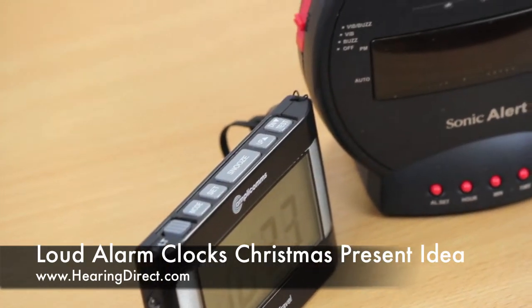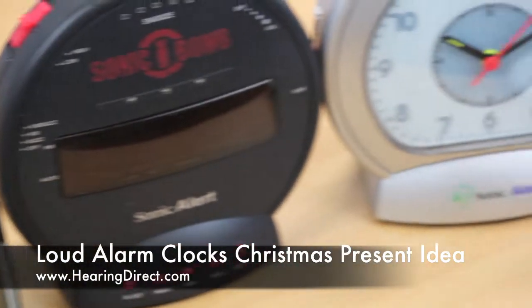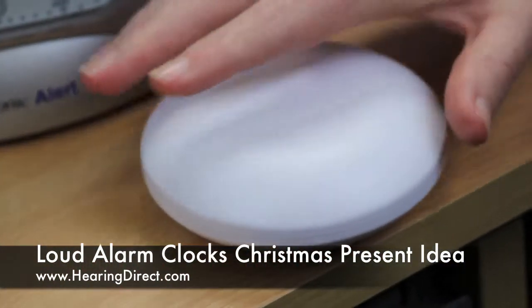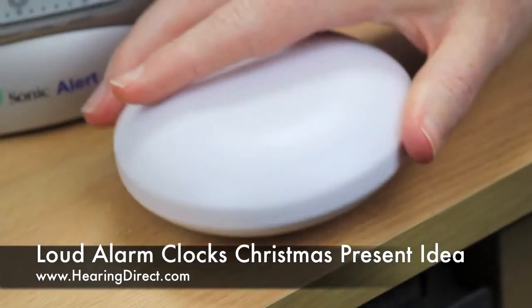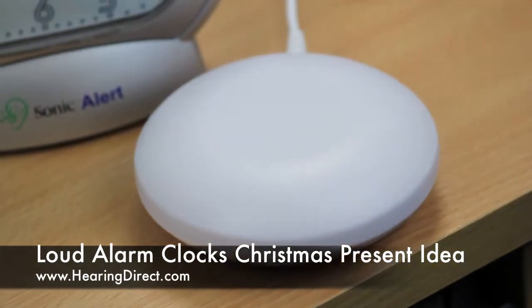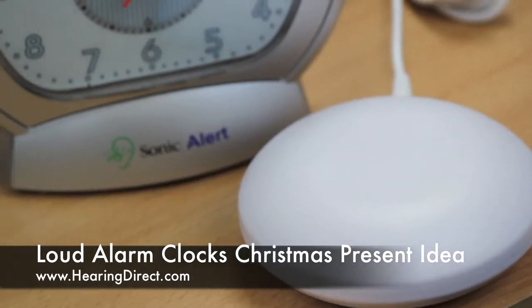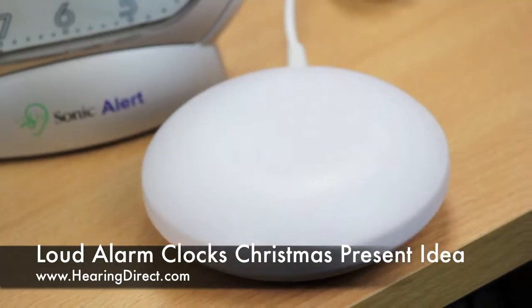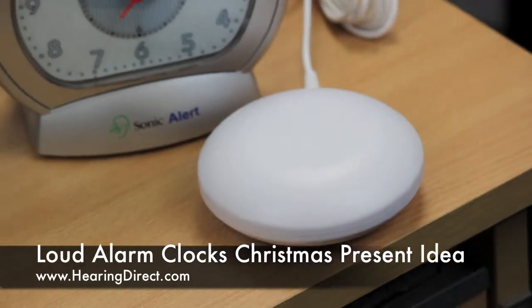On the other alarm clocks, you can get these shakers — they do come as standard — and these are designed to be fitted underneath your pillow, and when the shaker function on the alarm is selected, these vibrate to offer an additional method of getting you up.